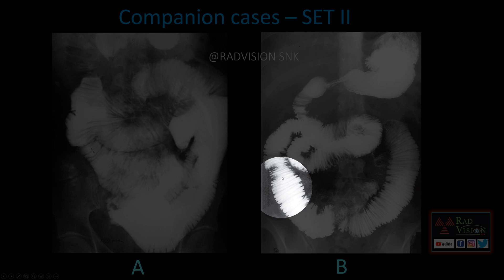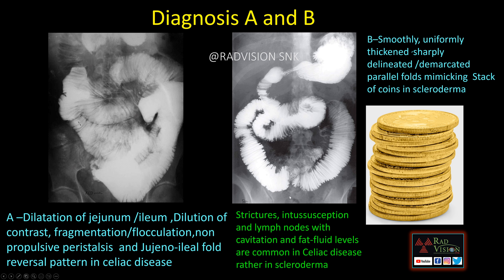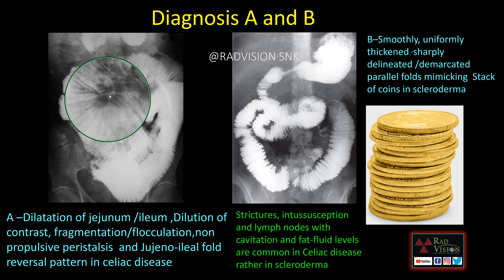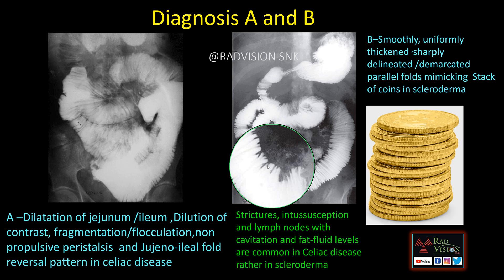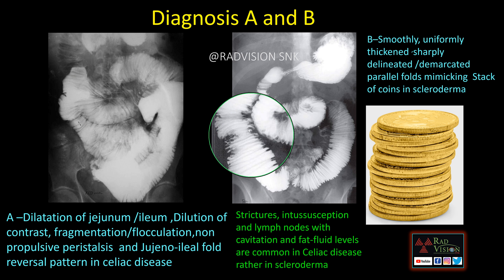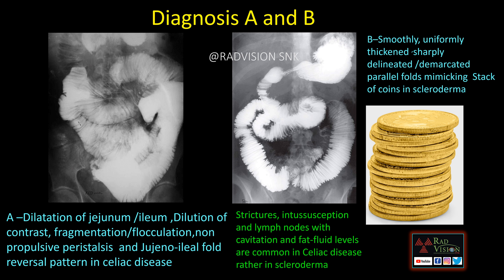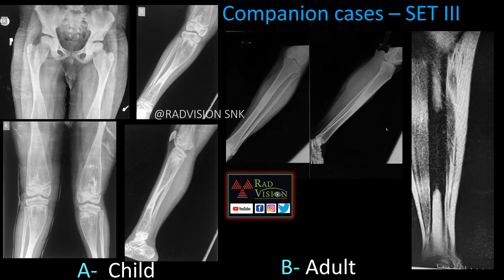The valvulae conniventes show the typical stack-of-coin appearance seen in scleroderma. The first case shows dilation of the jejunoileum, dilution of contrast, fragmentation, flocculation, and jejunoileal fold reversal pattern — this is celiac disease. The second case with multiple parallel valvulae conniventes making stack-of-coin appearance is scleroderma. Strictures, intussusception, and lymph nodes with cavitation and fat-fluid levels are more common in celiac disease.